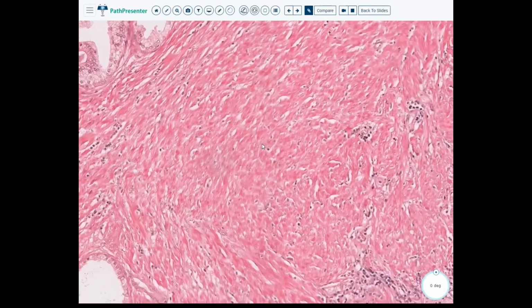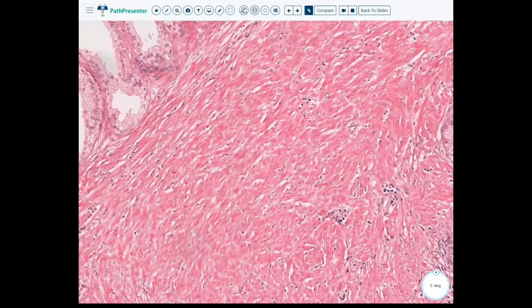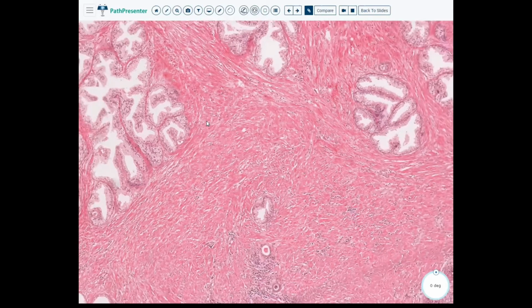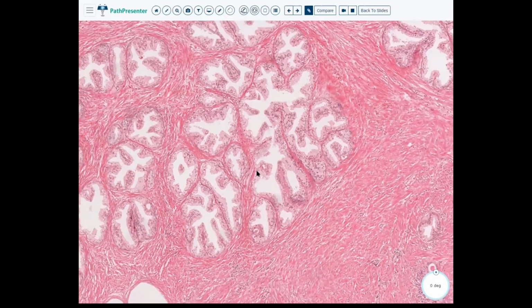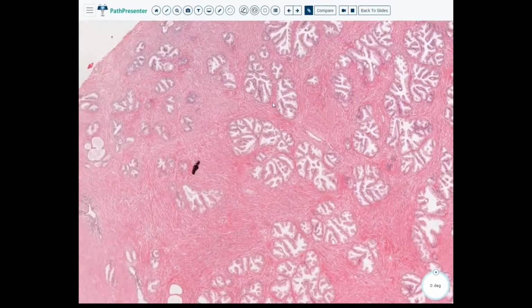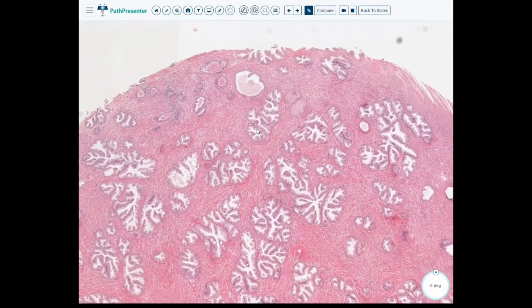Just want to zoom in on this interstitial component a little bit. And what we can see is that there's some collagen, maybe it's a little on the fibrotic end, a little more than we would definitely anticipate seeing in the prostate as well. And if we look at our prostate glands themselves, maybe easier if I go to low power, the prostate likes to have a very lobular appearance, very much similar to breast, right? So we expect to see lobular arrangements. You would be concerned if you were seeing things that looked a little more linear.